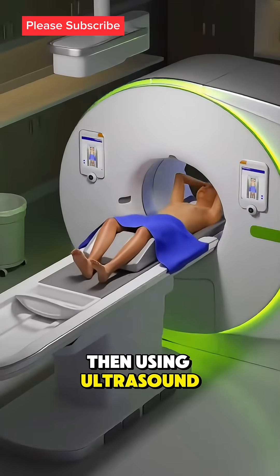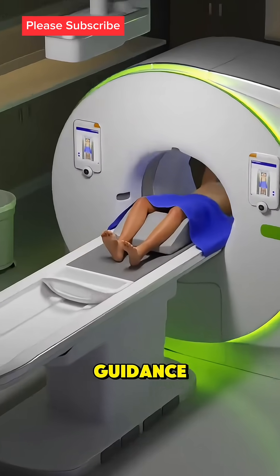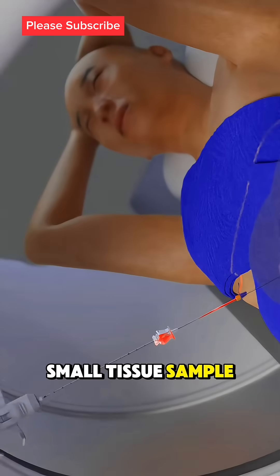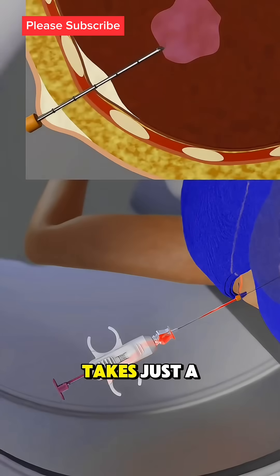Then, using ultrasound or CT scan guidance, a thin needle is inserted into your liver to take a small tissue sample. The whole process takes just a few minutes.